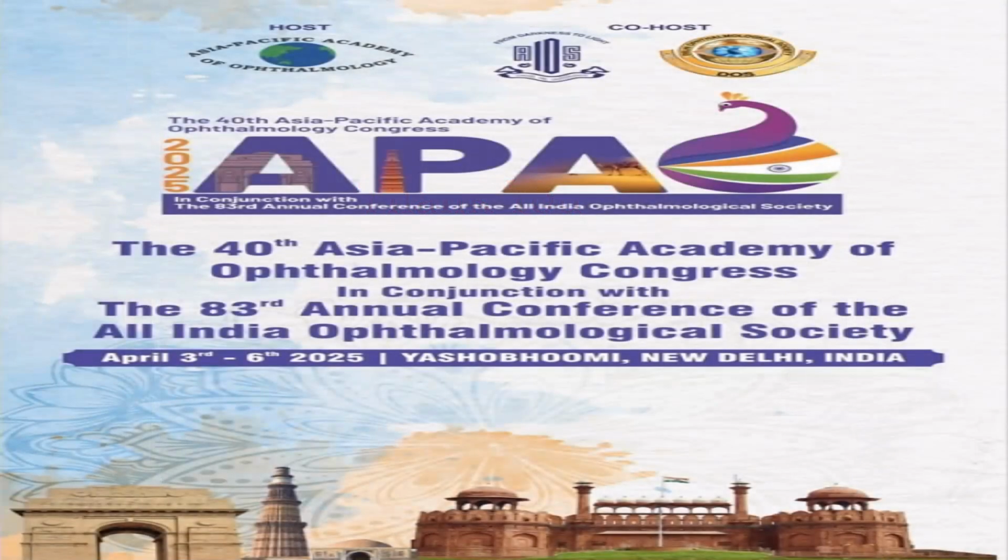Thank you, Dr. Arthi Singh, for a nice presentation, an excellent presentation. You have already opened the options to the audience. Now it is up to you to choose which option is better, but definitely I can say the retropupillary iris claw lens is better, because these different procedures have their advantages, merits and demerits. So we will conclude later which is better.